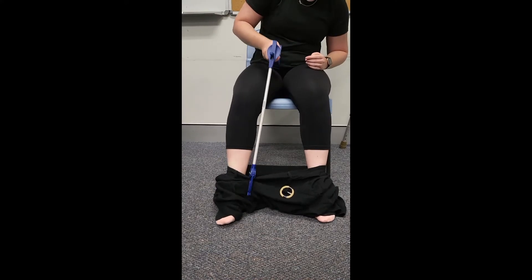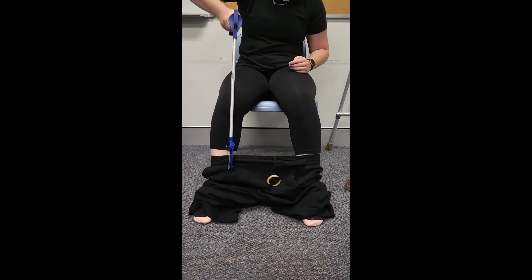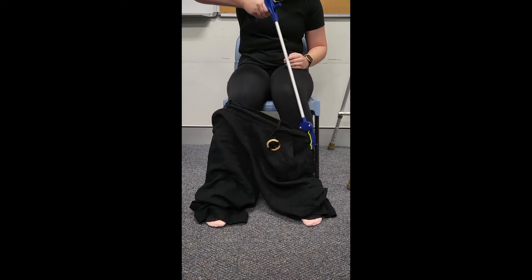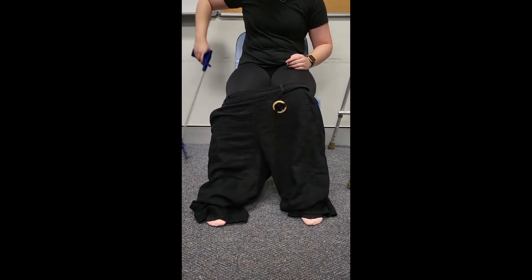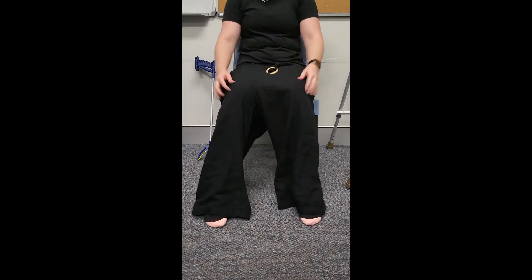Once both feet are through the leg holes, use the reacher to pull the pants up the leg by pinching the material between the gripper ends and pulling upwards with the reacher. Continue to feed the pants up the leg until they can be reached with the hands without bending forwards.